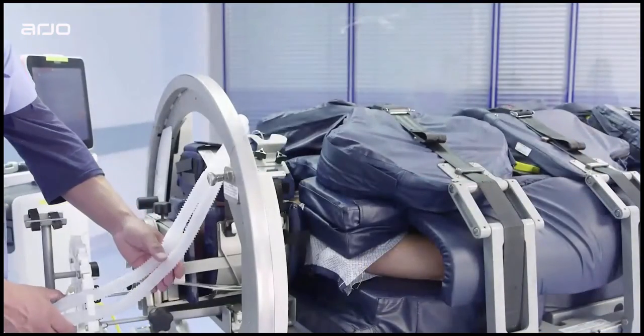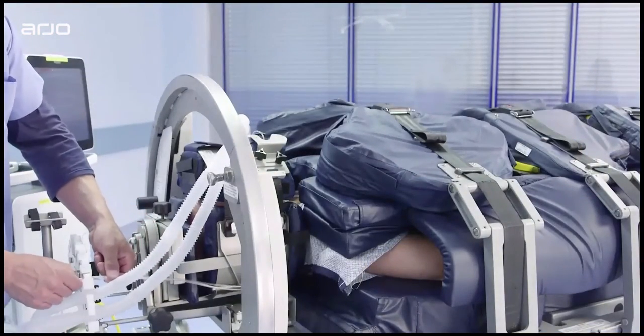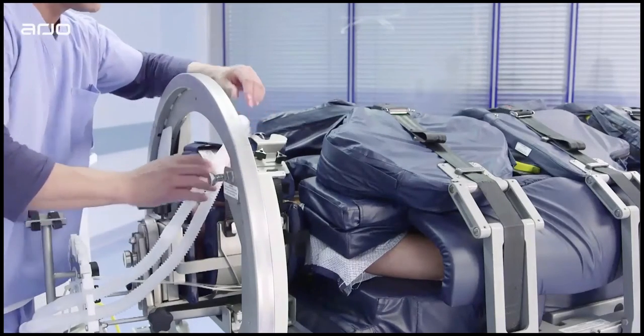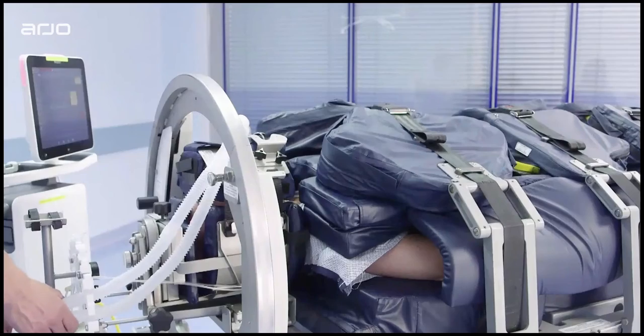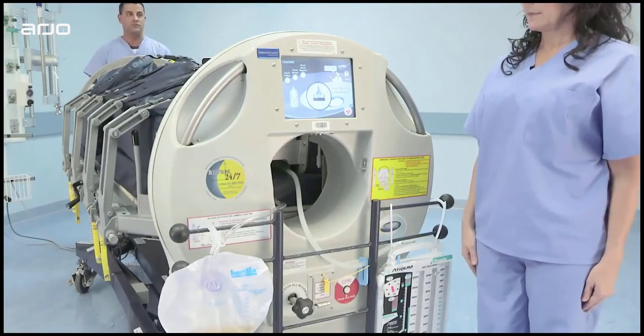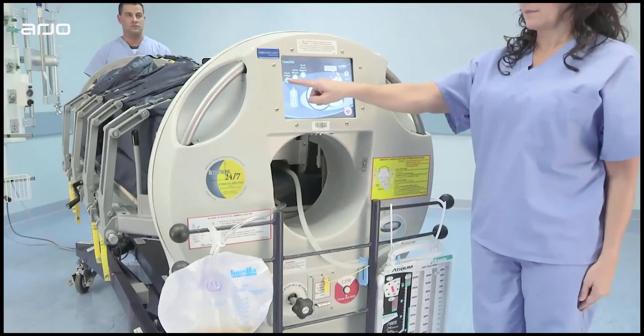First, assess all invasive lines and tubes, ensuring lines are secure and have adequate slack to avoid pulling, tangling, binding, or dislodging during a full rotation. Once all lines are adequately secured, press the Check Tubing button.